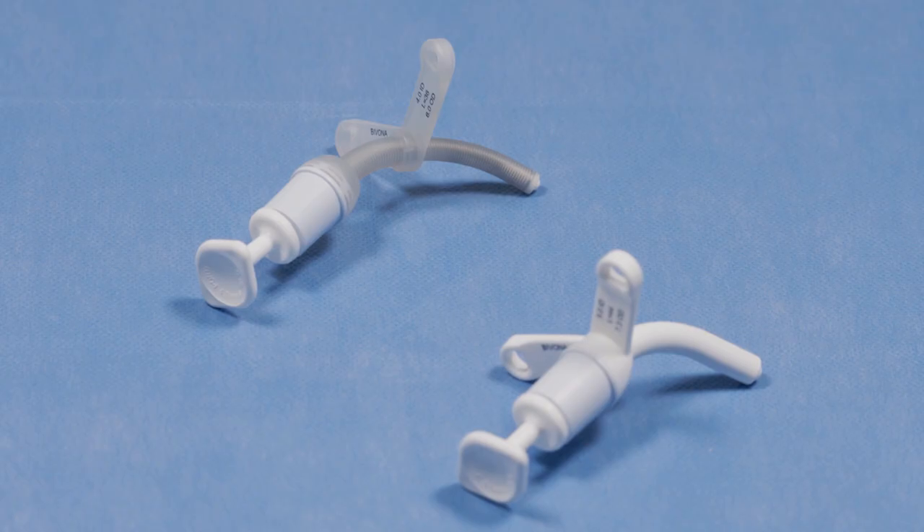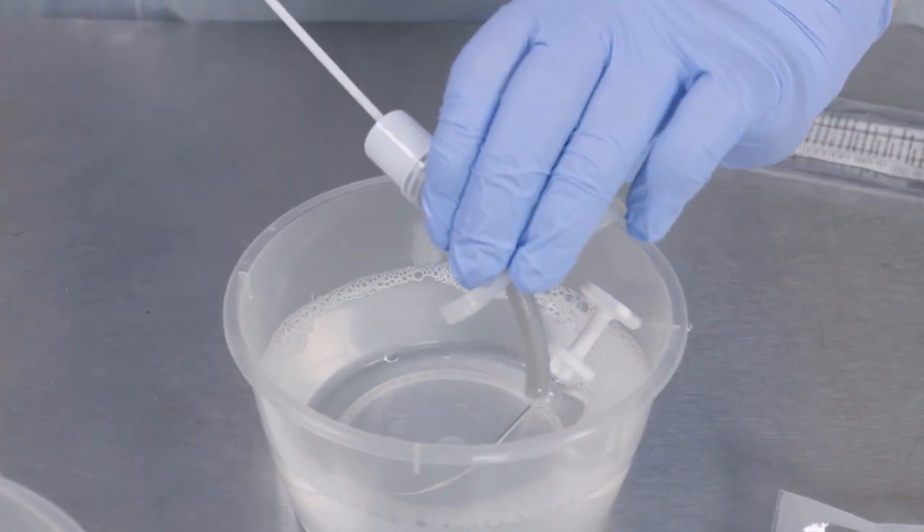Bivona tubes are made of silicone. Because of this, we can change them monthly. They can also be washed five times and reused for the same patient.